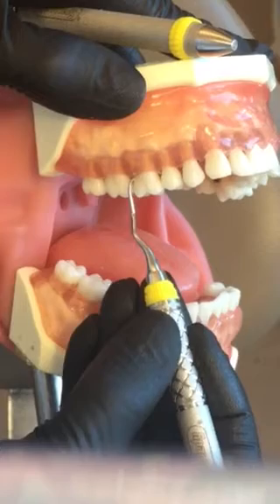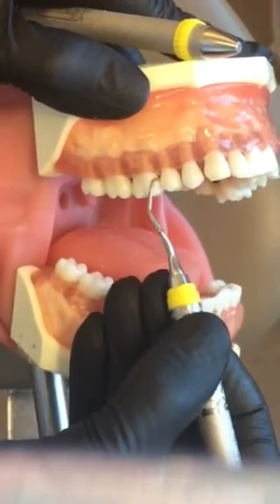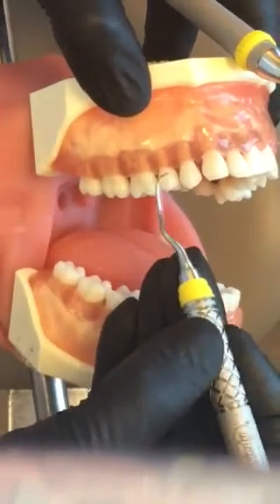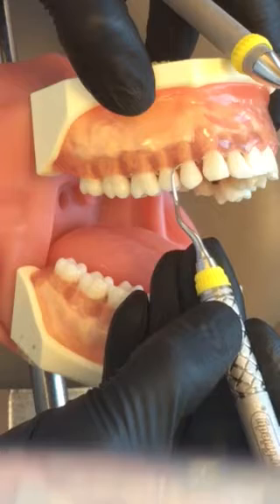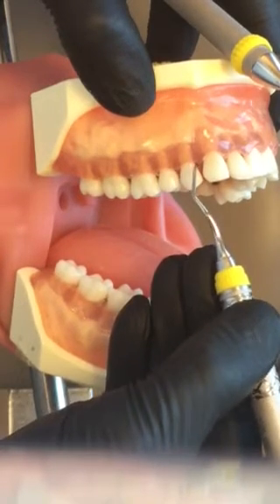From the distal line angle, I'm using oblique strokes, maintaining just an exploratory stroke unless I actually feel some calculus to remove — then I would switch to a working stroke. Continuing from the distal line angle in toward the mesial.